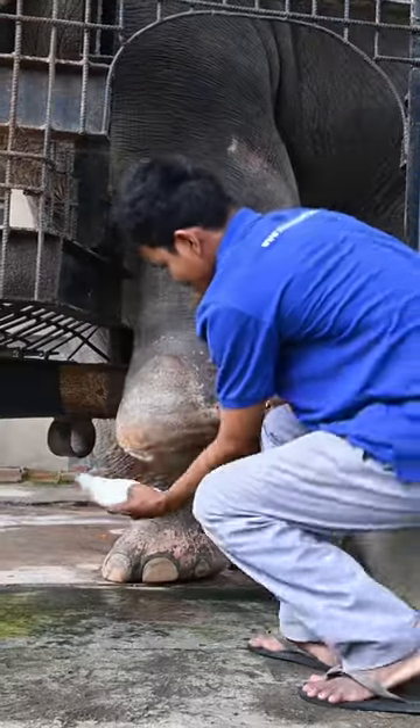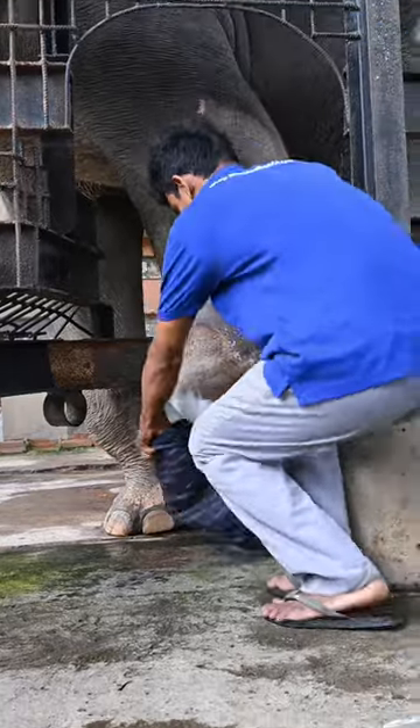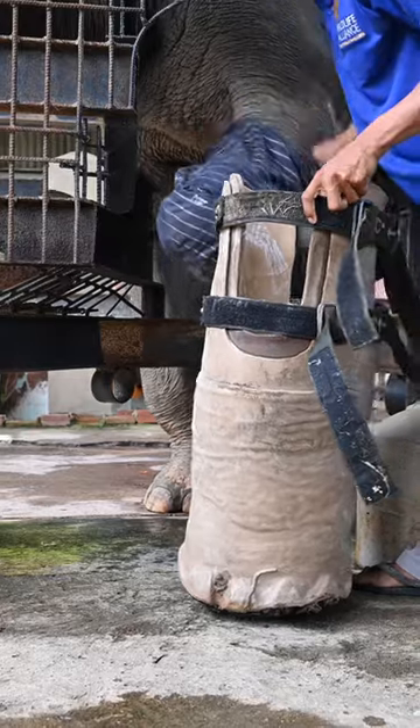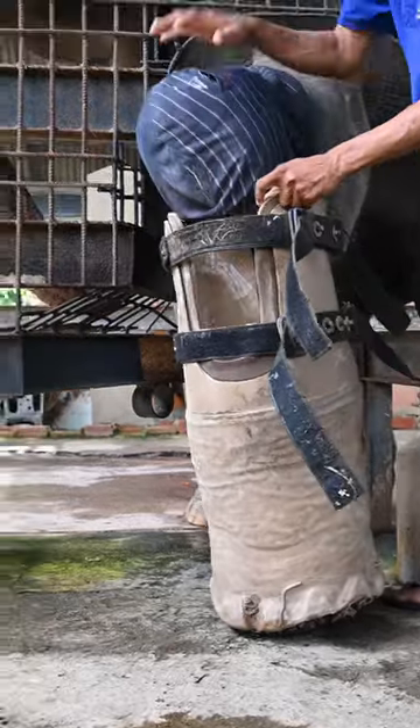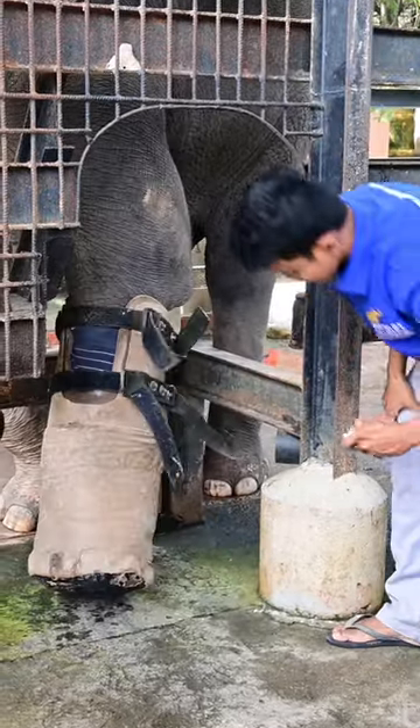First they clean it to reduce any infections and sores, apply the sleeve which Chuk kindly lifts his leg to make it easier for the team, and the foot goes on which is made from recycled tyres, plastics and foam just so it's comfortable for him — and this is all done through positive reinforcement training.